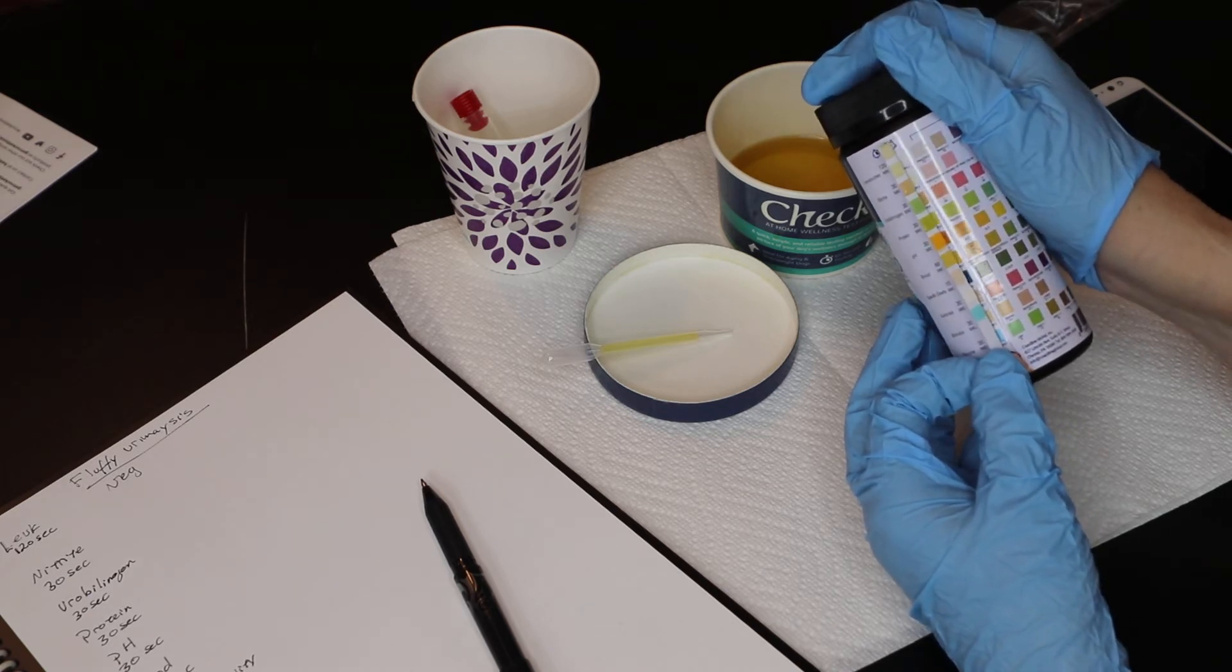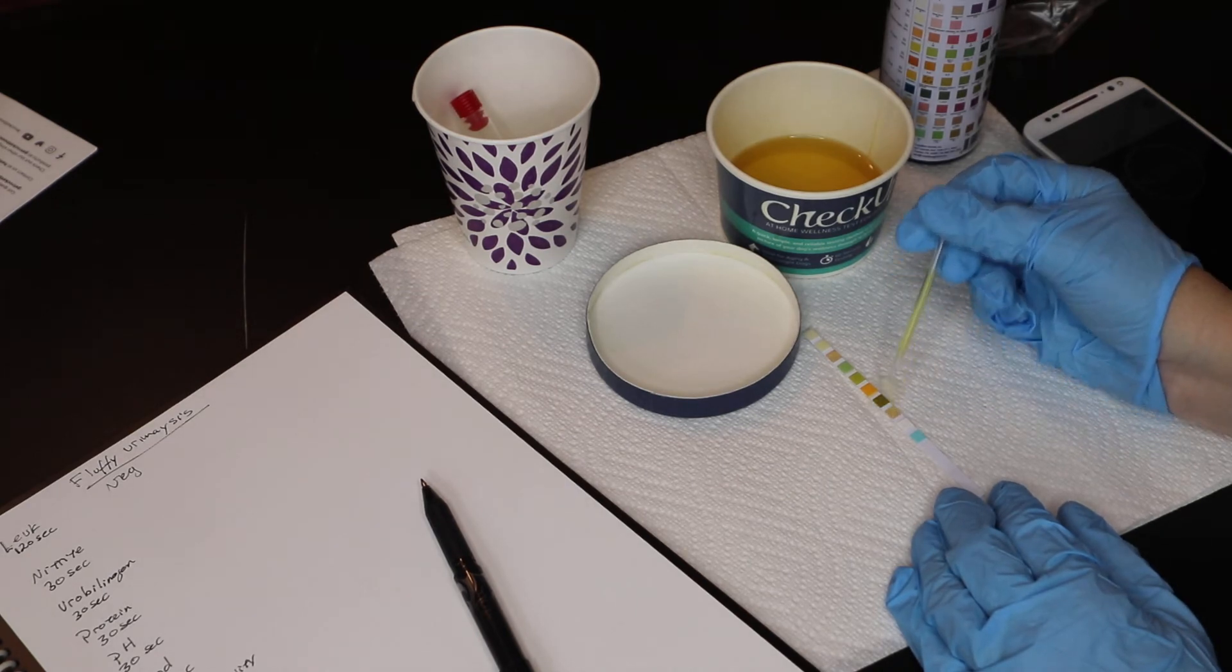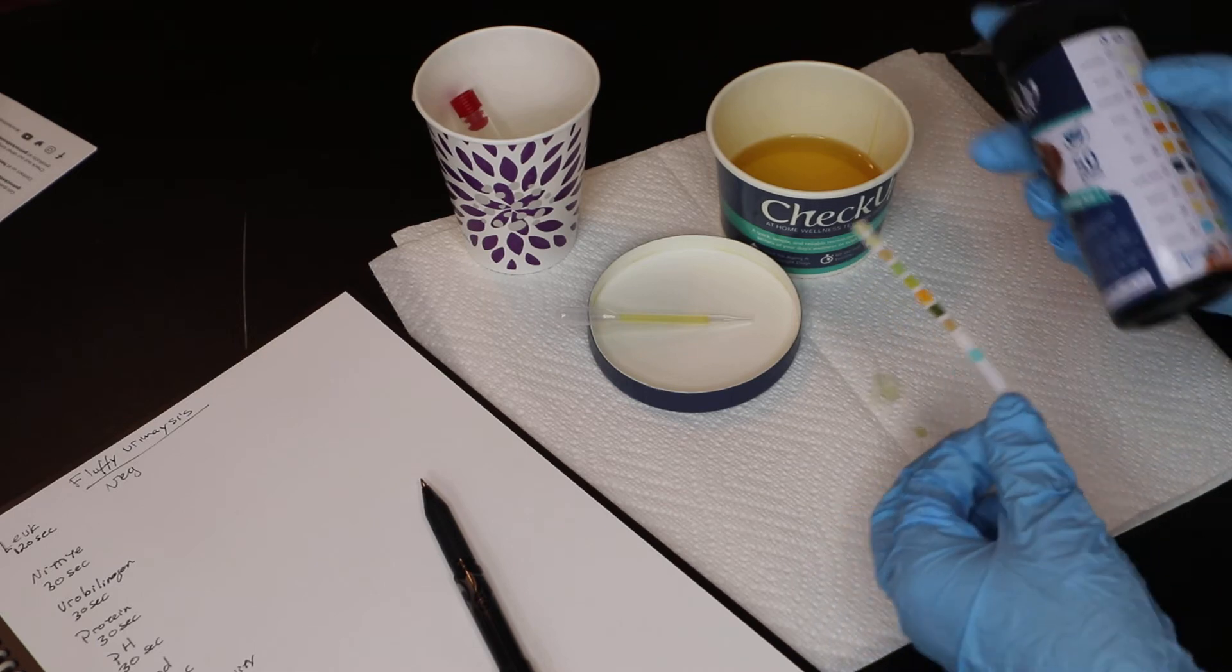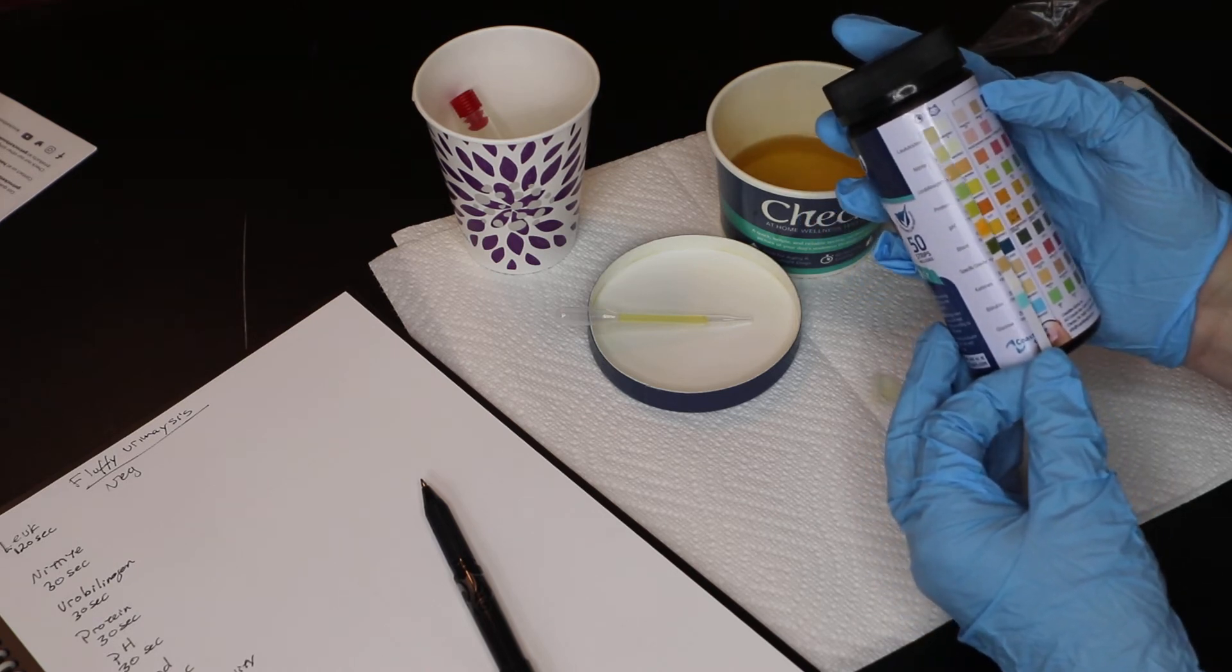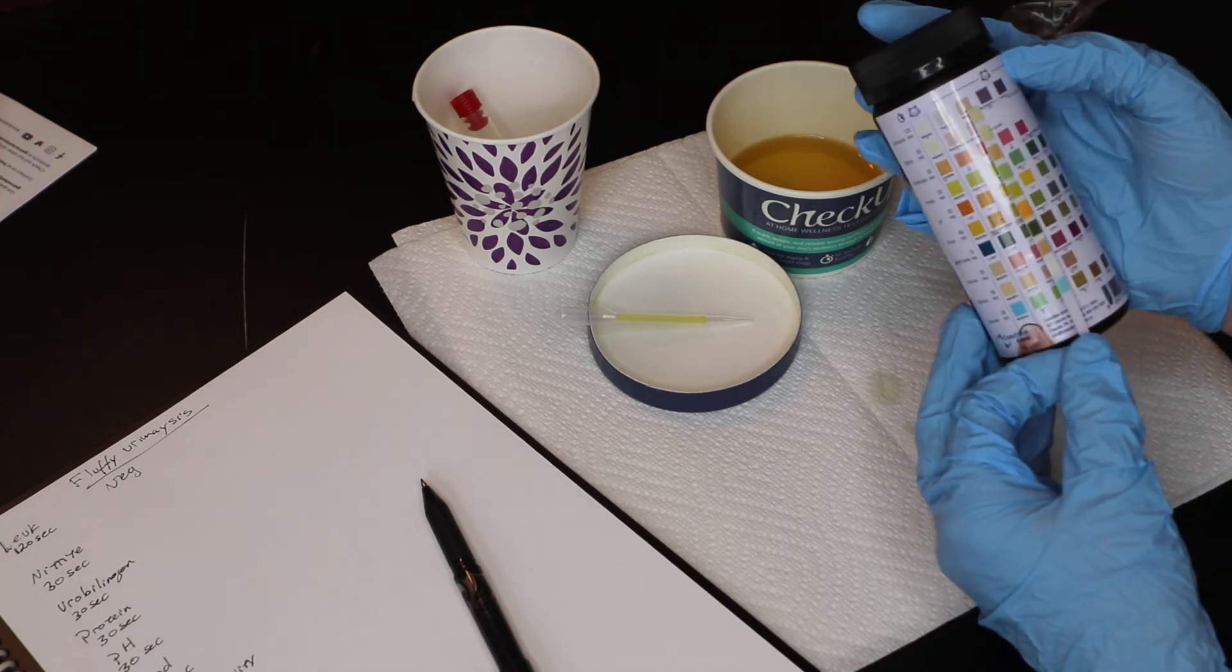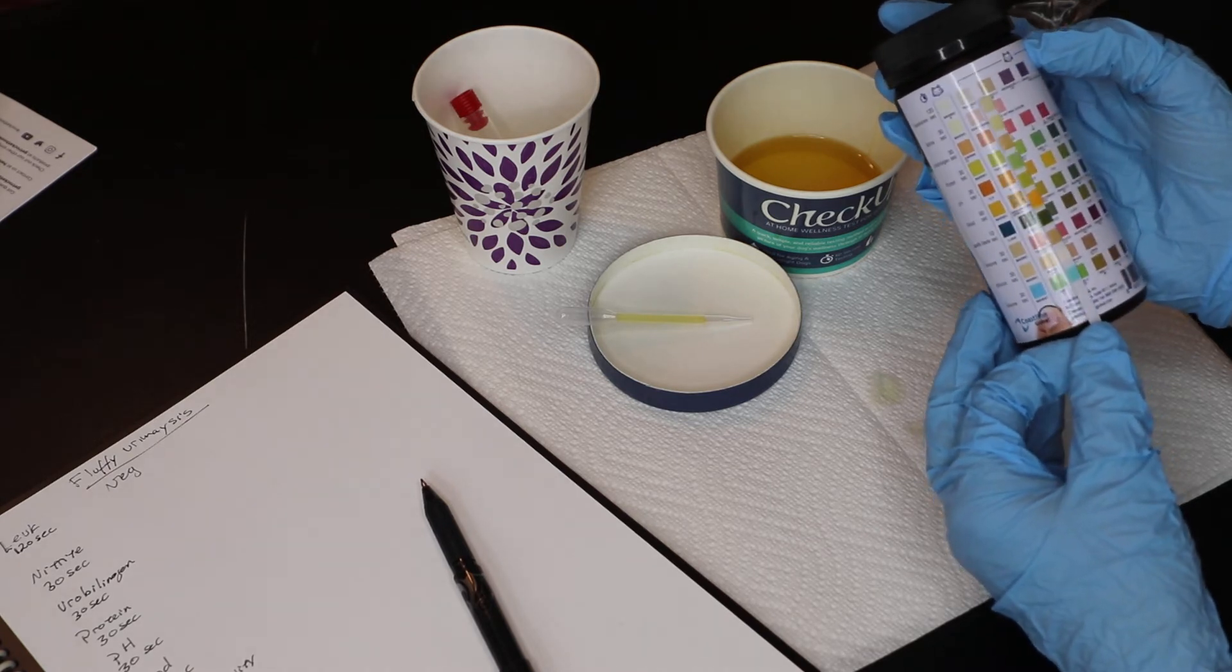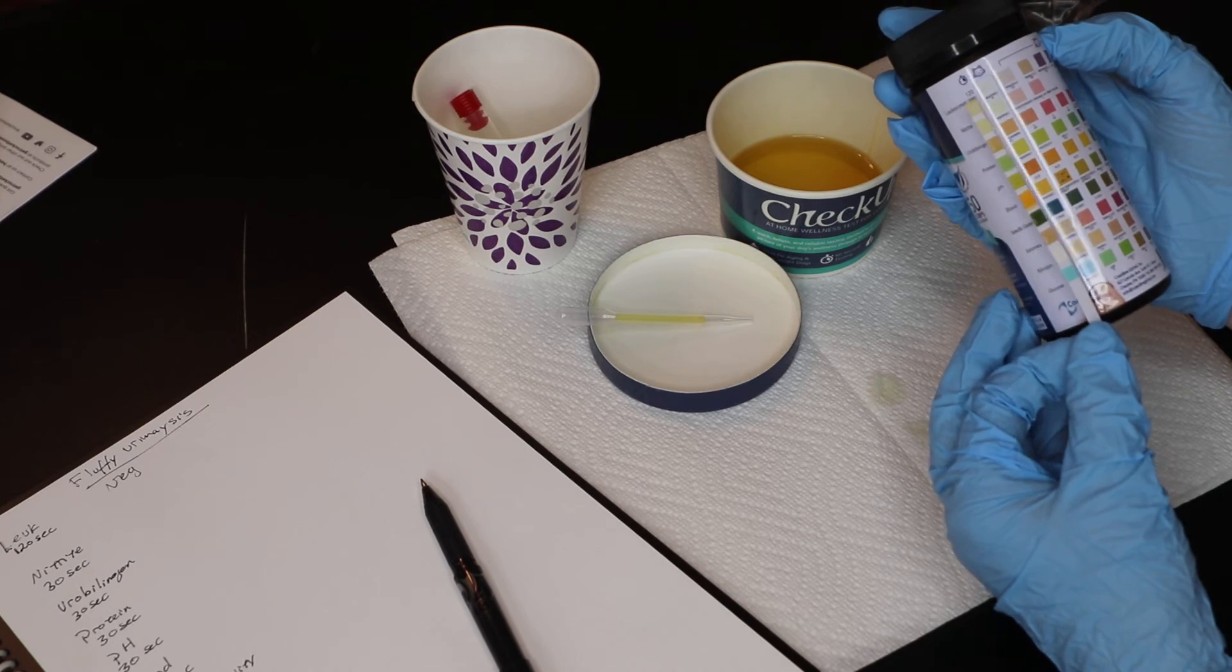And the next two pads are blood... So I missed a pad there. I'm sorry about that. So that's our 10 second one there. We've got that lined up. And that one lined up. 60 seconds on blood. That one's negative. Our specific gravity is around 1010, 1015. Next one is ketones. That one's negative.